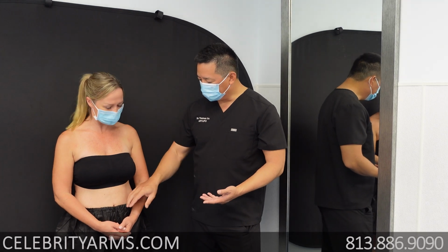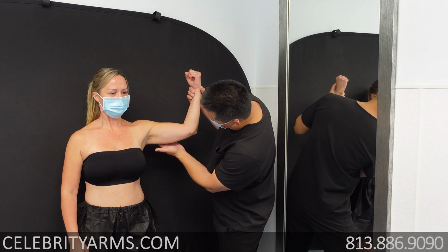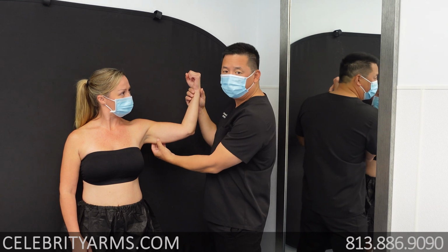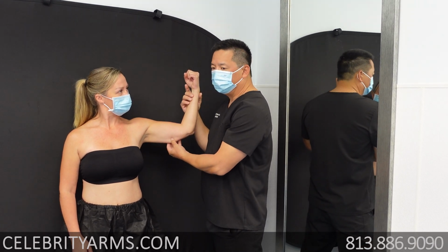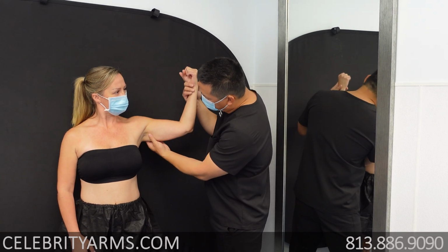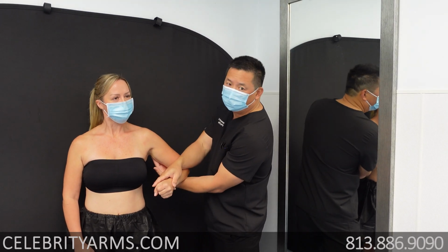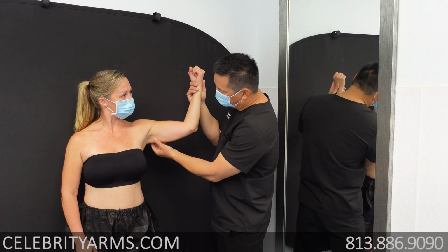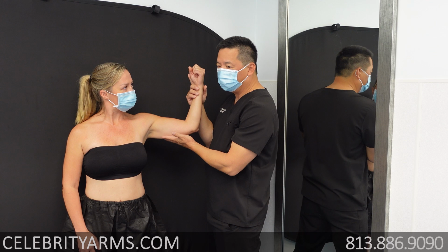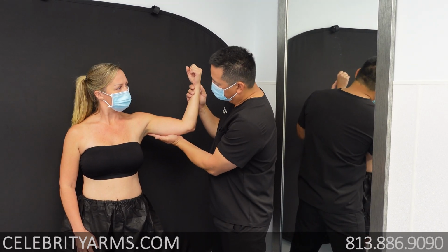You'll let us know. And then let me raise your arm up a little bit. So she's got really nice arms right here, but this is going to come up about like this. There's about 3/4 of an inch of fat right here that's hanging down. That fat becomes more apparent as we age because the skin does get more lax and everything droops from the sides. Everything comes down, even though when it's at your side, it's distributed a little bit differently on the arm. We raise it up, it kind of drops here. When we take that fat out of this area, by the nature of what we do, with the sculpting alone, the skin is going to pull up and it's going to look really good.